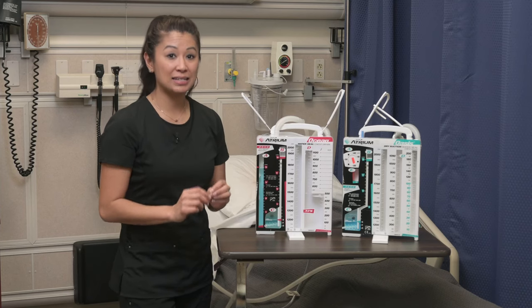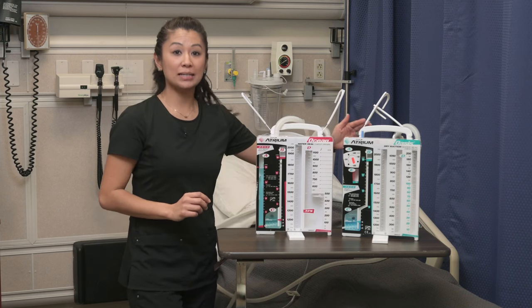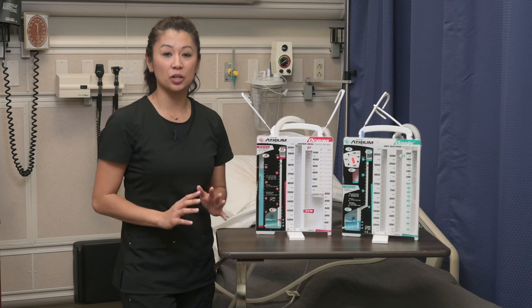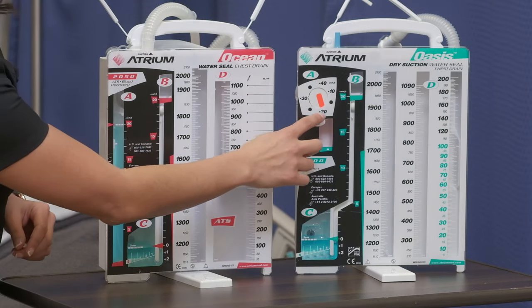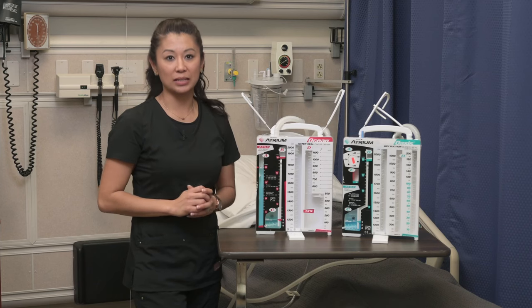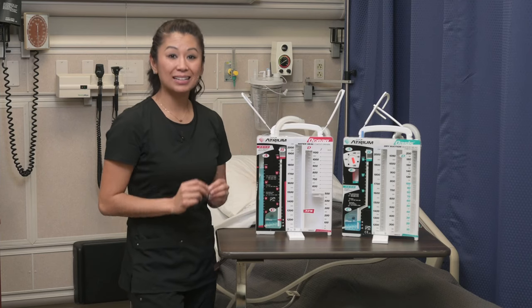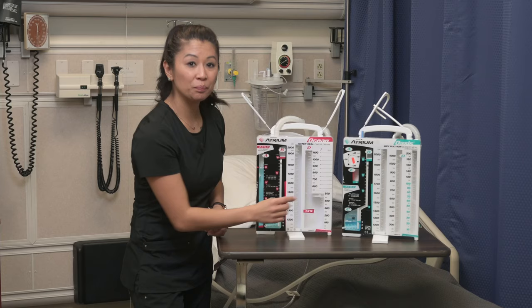Now let's look at a difference. With dry suction, there's a dial, which makes it much easier to know what prescribed suction order is set. If you look at this one, it's at negative 20, which is going to be the most common suction setting you'll see.